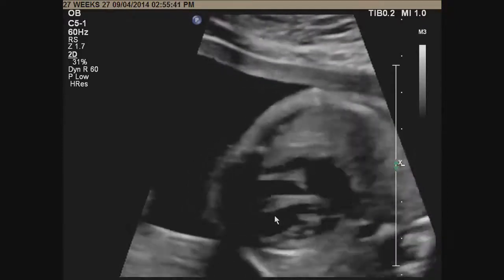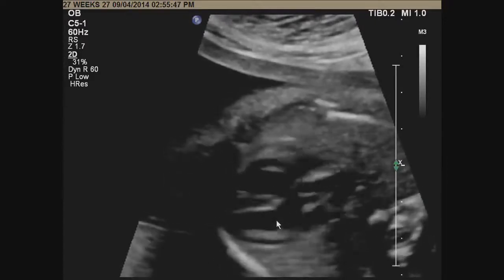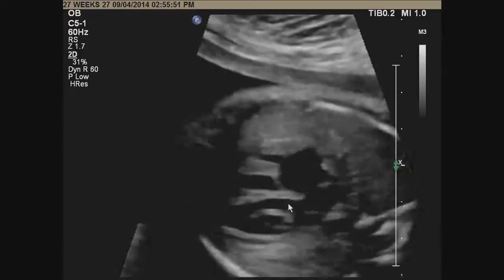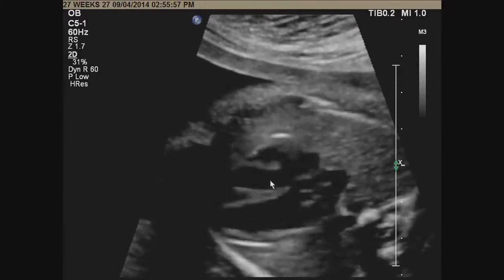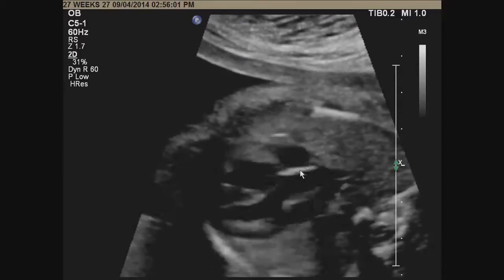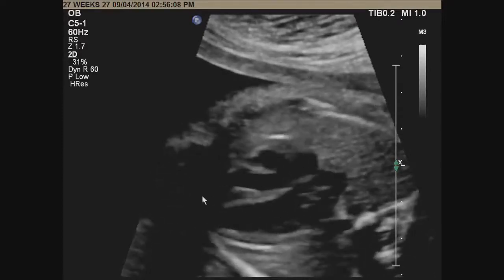So now I'm going to work a little bit on the four-chamber view. So I'm going to the five-chamber view. So I'm going to angle to get the left ventricular outflow tract, and I'm going to discuss several features of this view right here. So first, I want you to see the angle that the ascending aorta makes with the ventricular septum. You see there's a nice slight angle, about 20 or 30 degrees, that the ascending aorta makes with the ventricular septum in the normal heart.